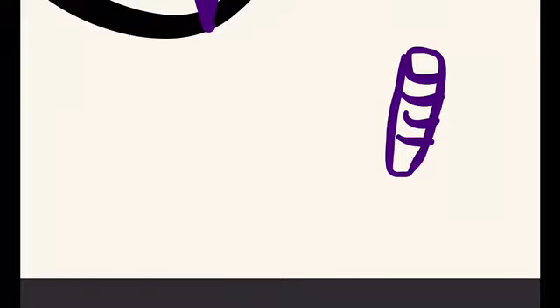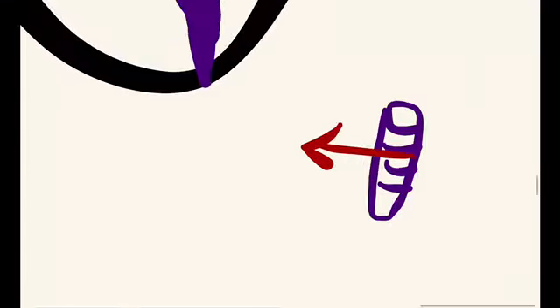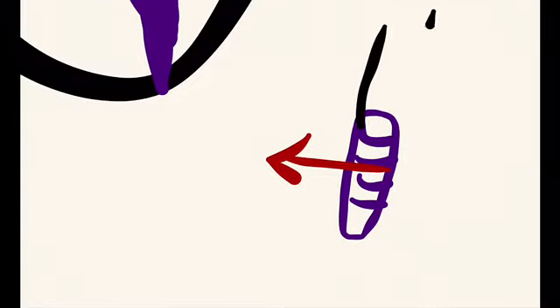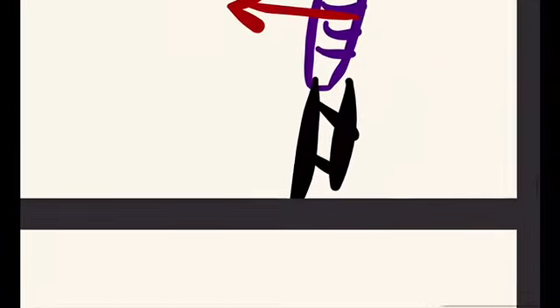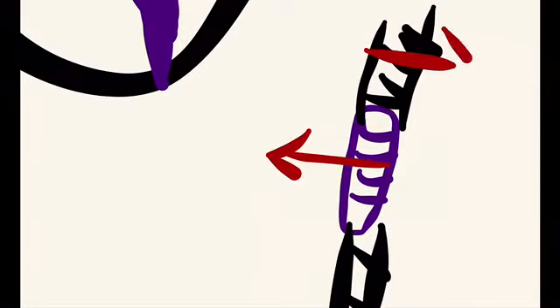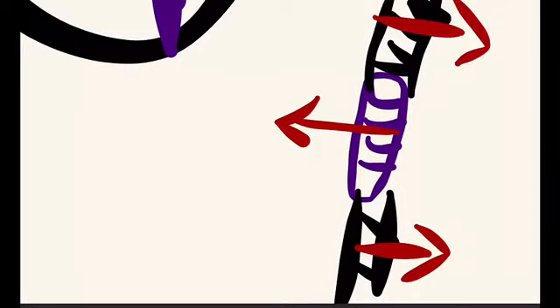This dead tissue also originates a depolarization wave, which is going away from lead V6. So this depolarization wave from the dead tissue is going in the opposite direction of the normal ventricular depolarization vector. The healthy tissue has a depolarization vector in this direction, but this dead tissue has a depolarization vector opposite to the normal direction.